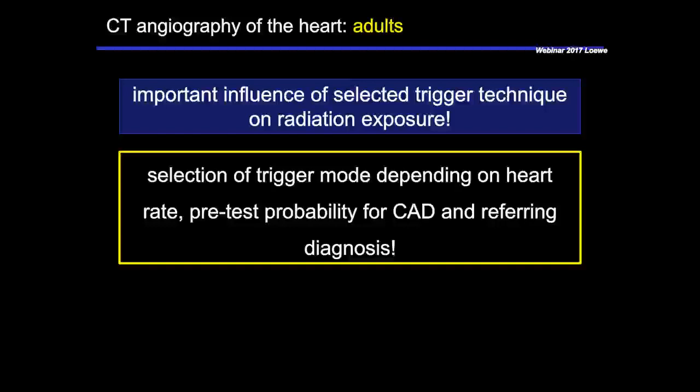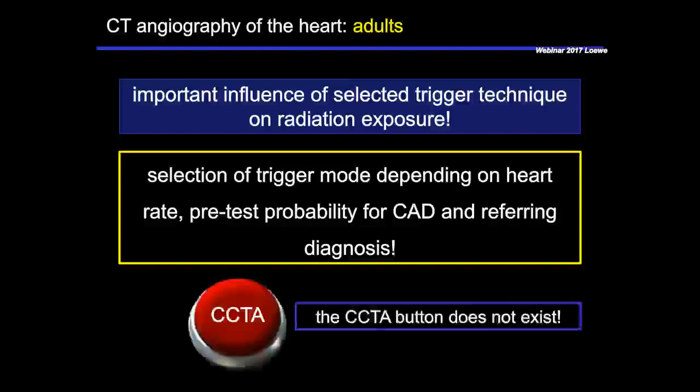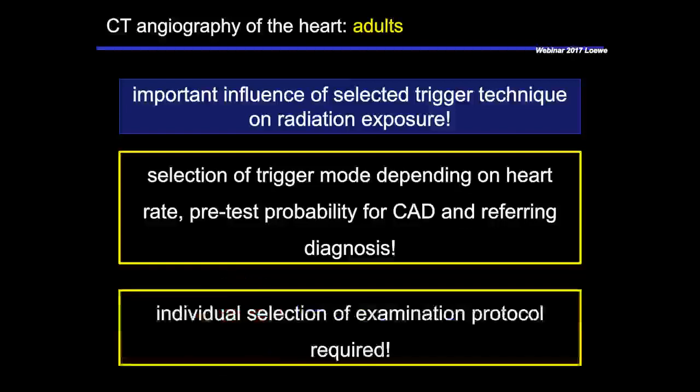In other words, the CCTA button does not exist anymore. CCTA becomes a little bit more complex, but of course, it's even more fun because we have more possibilities to improve and to provide better results. What we really need is the individual selection of the examination protocol.